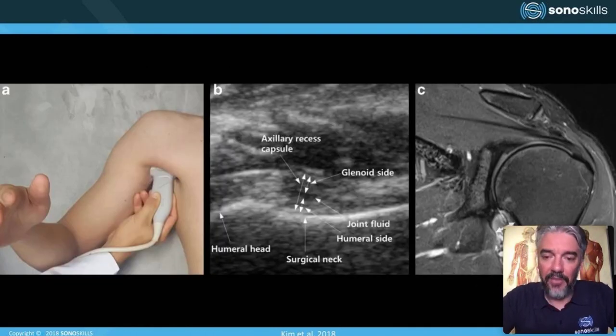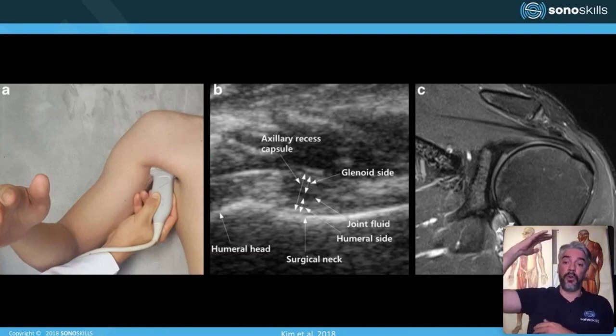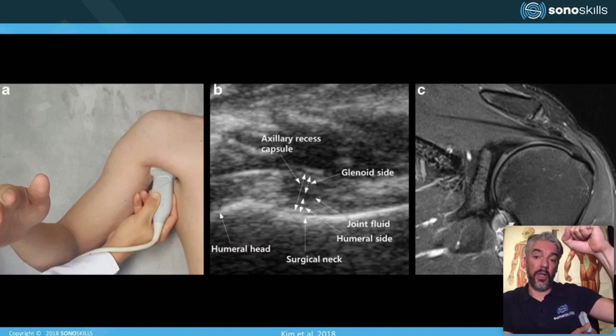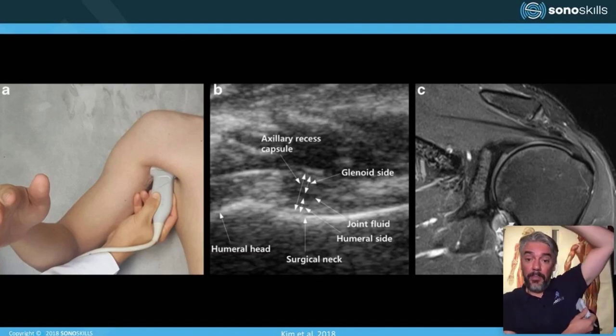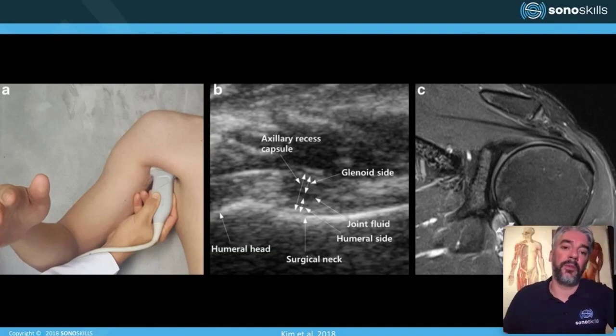Many patients have troubles with abducting or elevating the arm. So you could also practice with a limited range of motion how to do it like that. That's a little bit more challenging. But if the patient is flexible, you can go up and even move the arm in several positions and do ultrasound guided assessment.